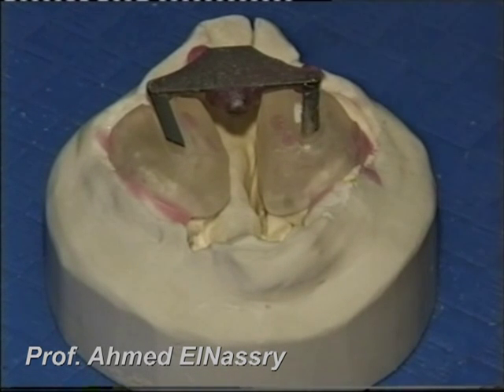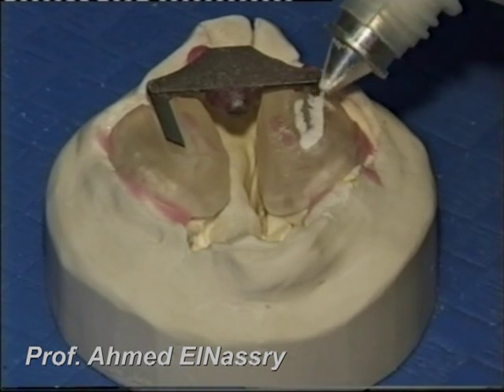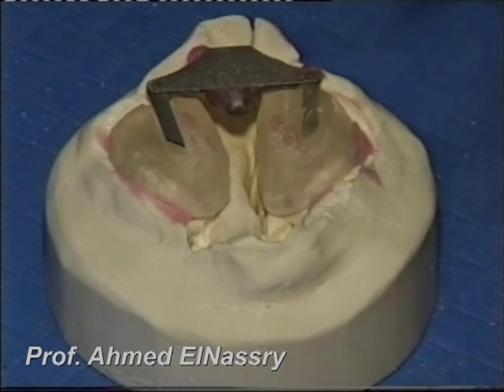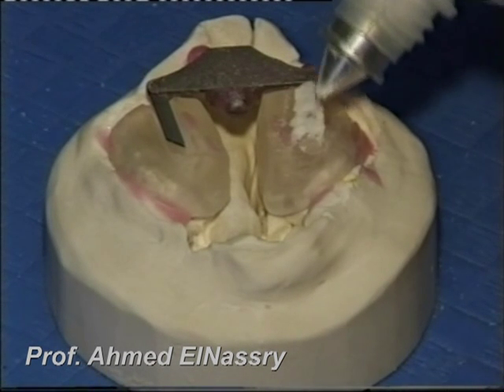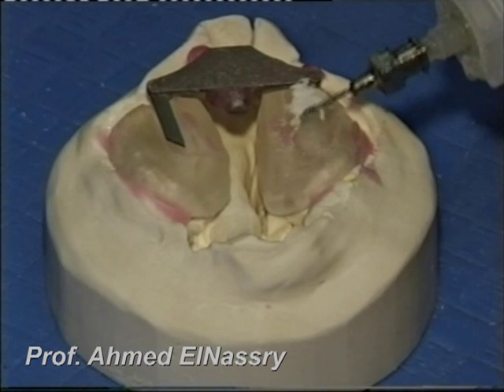The expansion screw is seated posteriorly over the hard palate. It has two arms, which are seated on the two acrylic portions of the maxillary parts and covered with acrylic resin.